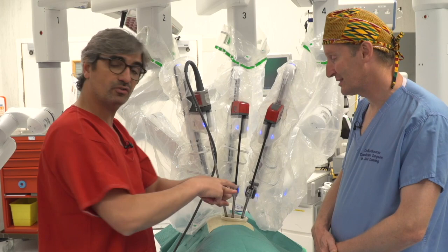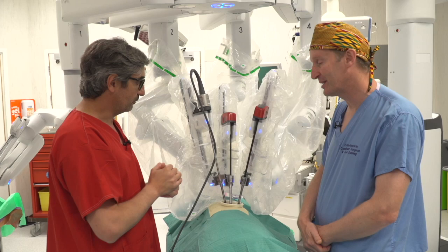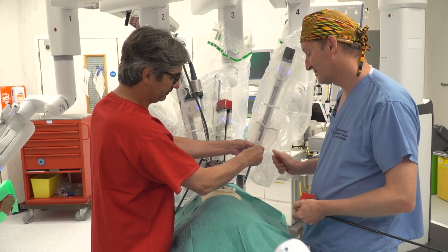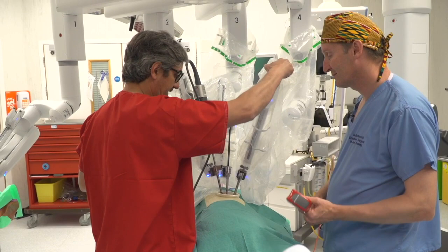Yeah. And if we want a staple, we're basically just going to take this arm out, put a 12mm cannula in with a short form 45. Exactly. When you want a staple, when you use the staplers, we need to remove this trocar. Normally it's the lower trocar. So we remove this arm, the arm four. Take that out. We change this for the 12mm trocar. We put it in again. Here you can see it's a little bit close, so we just move. Always some distance. And now he can use the staple.